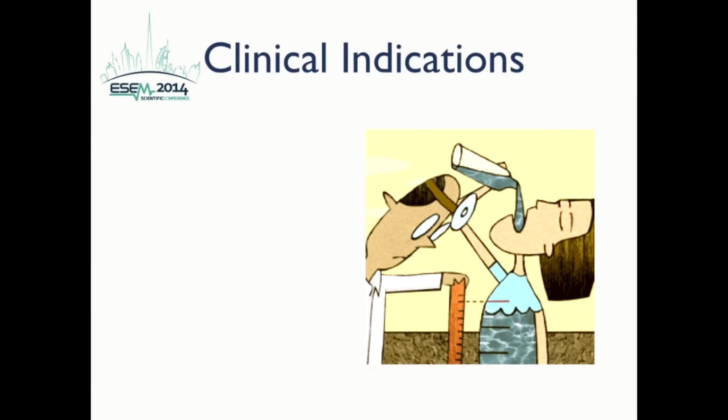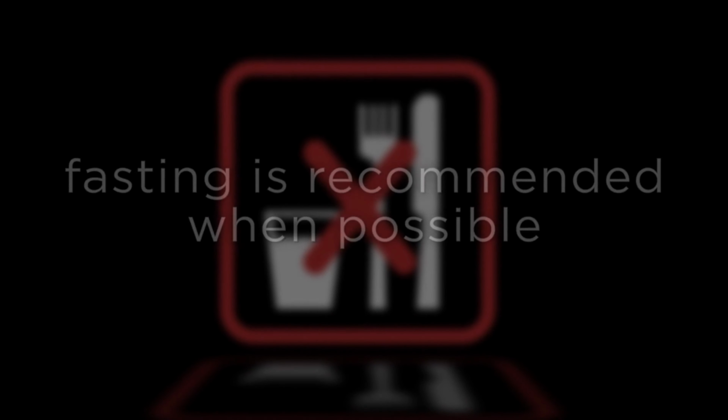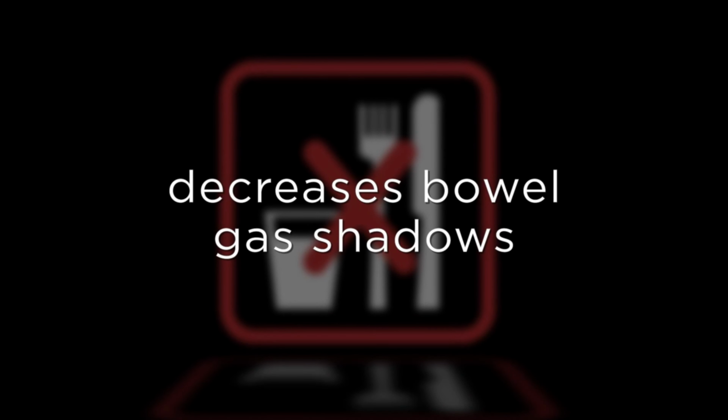The primary utility of bedside ultrasound of the IVC is to aid in the assessment of intravascular volume status of the patient. This may be a particular utility in cases of undifferentiated hypotension or other scenarios of abnormal volume states such as sepsis, dehydration, hemorrhage, or heart failure. Fasting before the exam is recommended whenever possible. This will aid in decreasing the amount of bowel gas shadows, which can drastically decrease the quality of images.